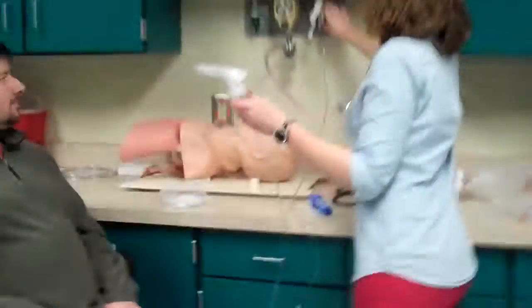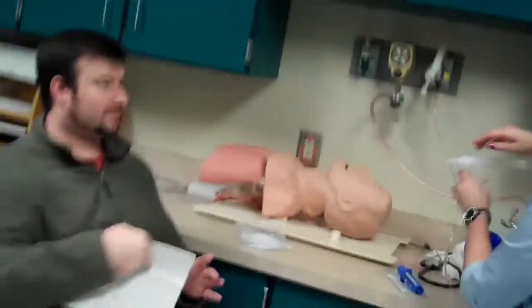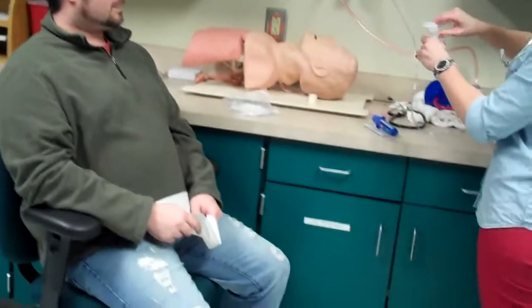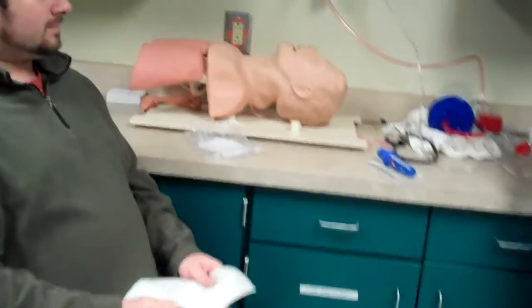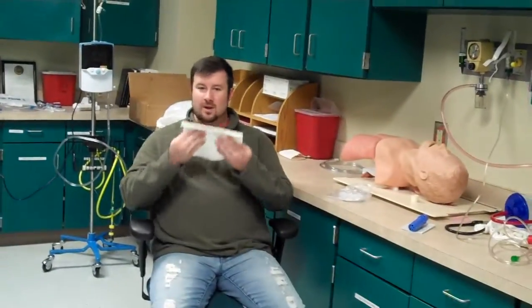Feeling okay? Alright. I'm going to get you to cough for me in just a second. Thank you. While I'm cleaning this out, could you do me a favor? I want you to cough good and hard. I want you to get it way out of there. And if anything comes out, you show me, alright? Okay. Get a good cough.